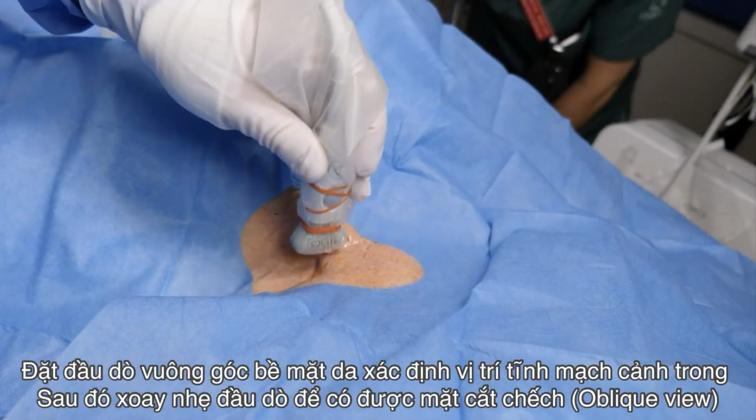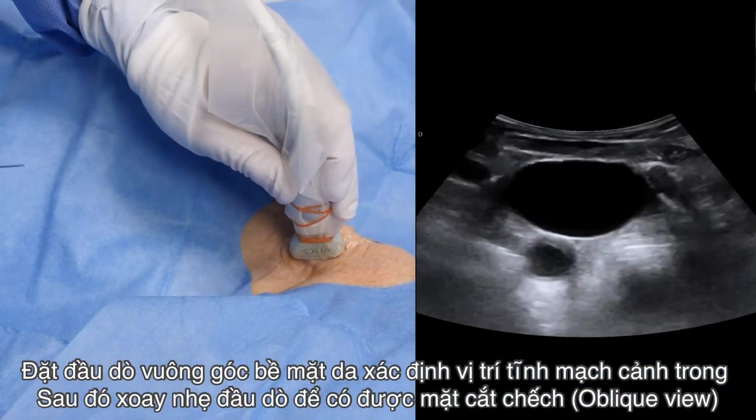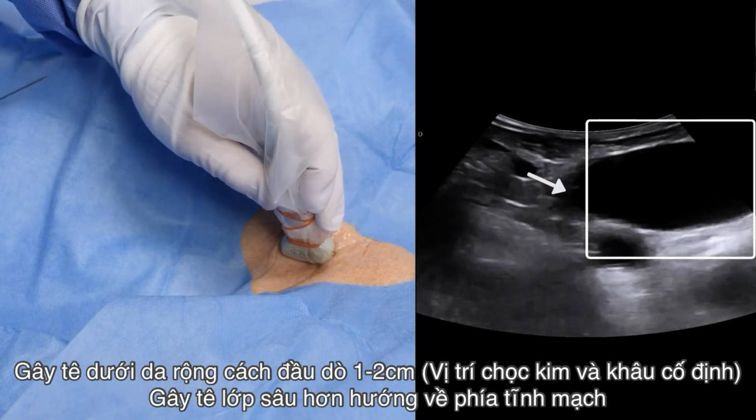Position the probe close to the clavicle. Locate the vessel and rotate the probe in order to get the oblique view. Place the vein medially in the picture so you're able to see the cannula approach path.